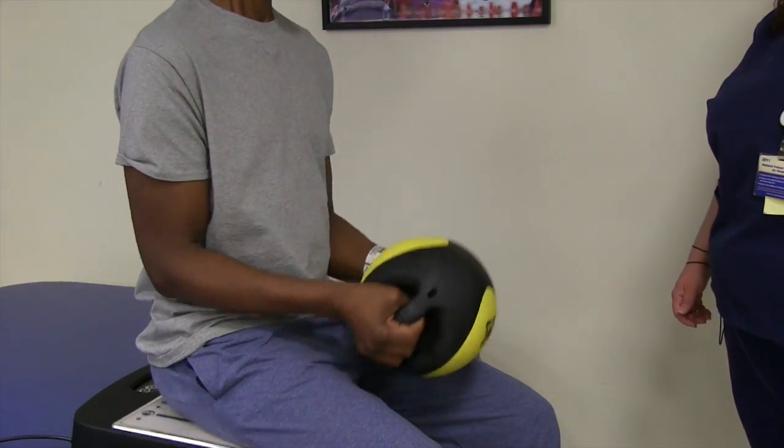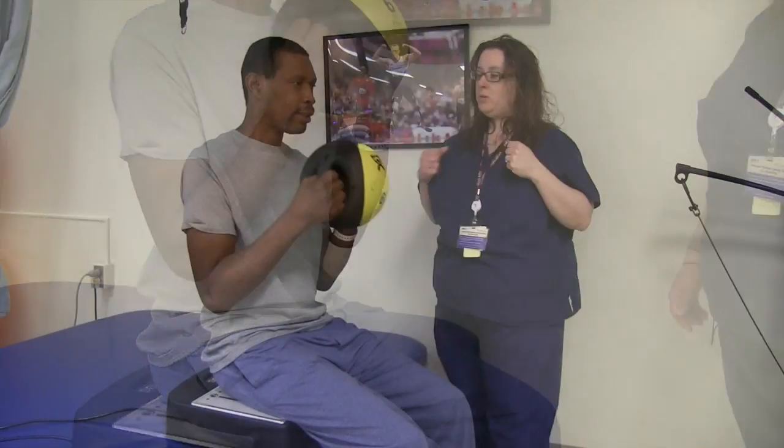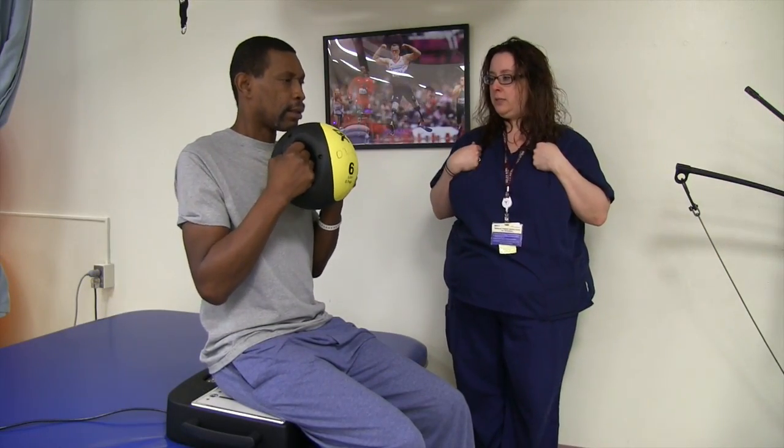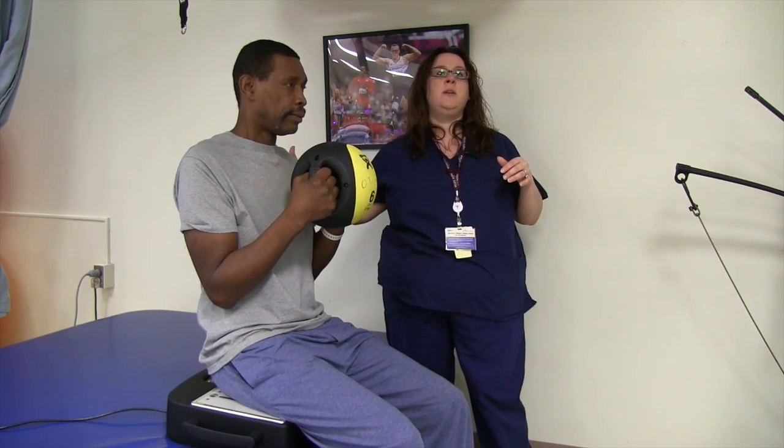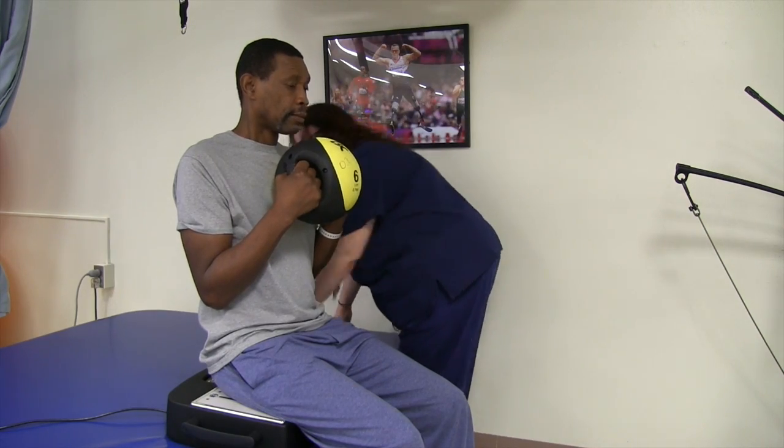You're doing great and you're making it look easy. Hold it out at your chest — you're going to go back a little. Now we're going to do this for two or three minutes. Any point you're uncomfortable, you just say stop. Okay, you ready? All right.